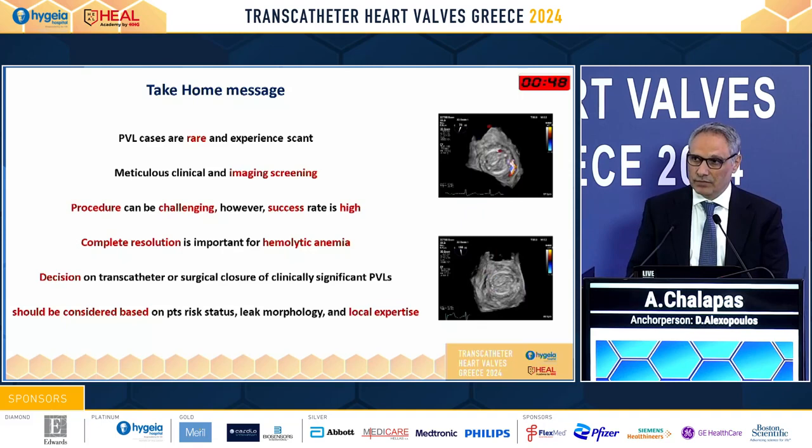that the paramitral defects are relatively rare. There are less than 40 cases per year in our country. Imaging is of meticulous importance. The procedure can be challenging, however, the success rate is very high.